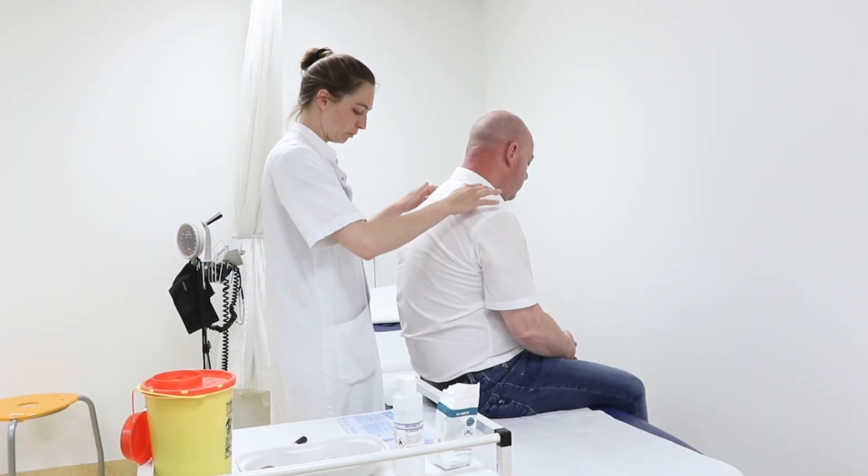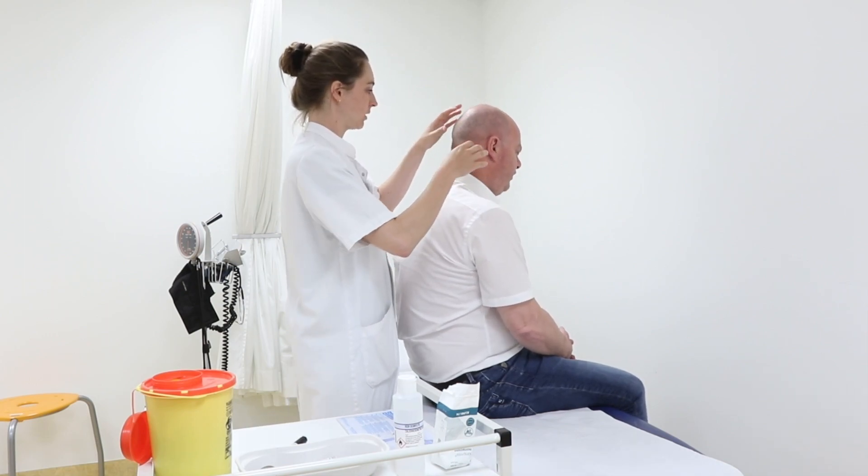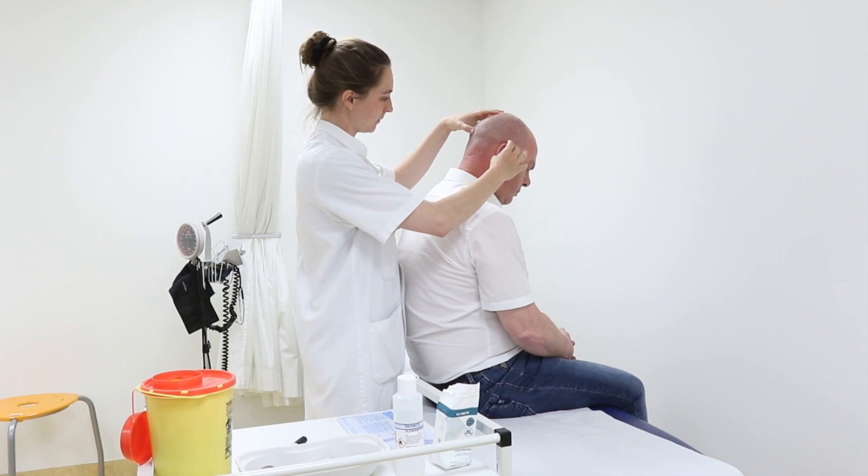Position the patient with his or her back to you in a sitting position. Use a bench for this, so the patient can lie down if necessary if he or she becomes vasovagal after the injection.